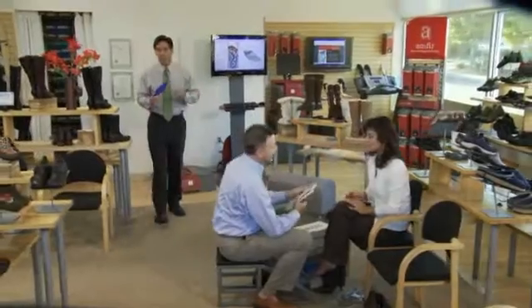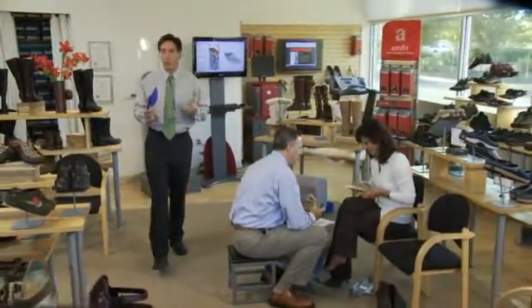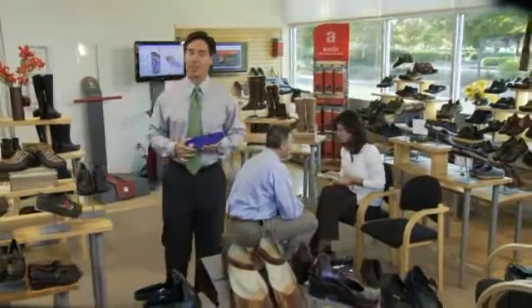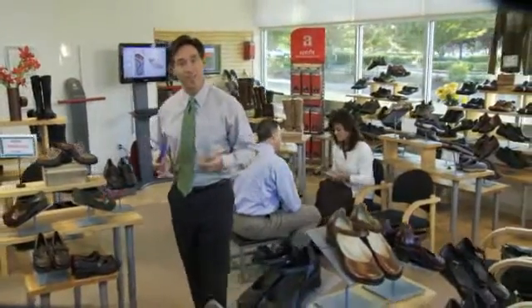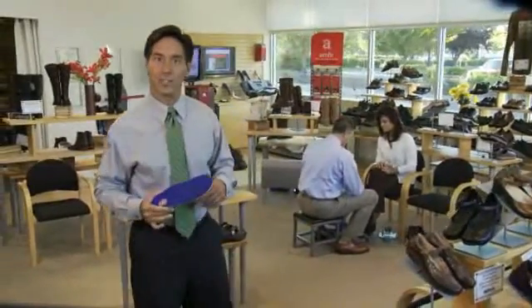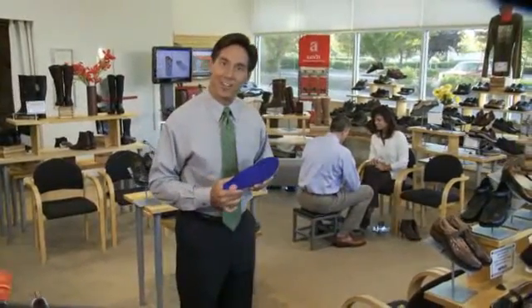Whether you're a podiatrist, a physical therapist, a CPED or an orthotist, let's face it, you want to provide the most effective foot orthotic for your patient. And to do that, you need accurate casting, fast turnaround, and quality materials. That's where Amfit's technology comes in.